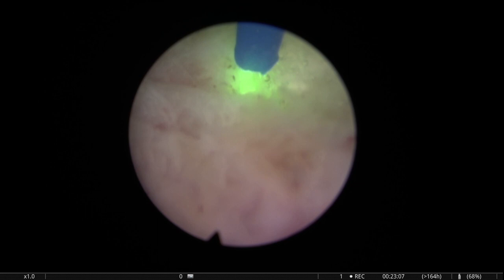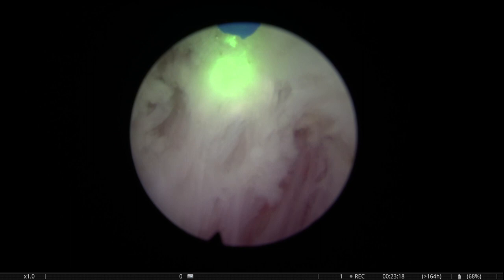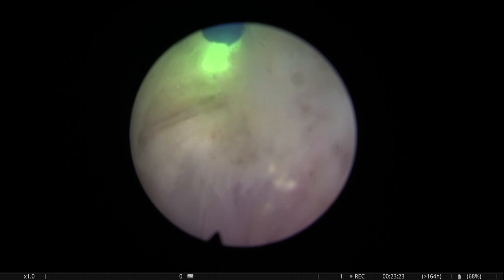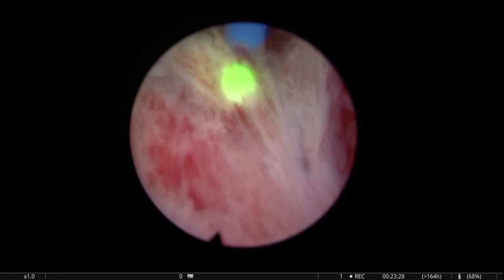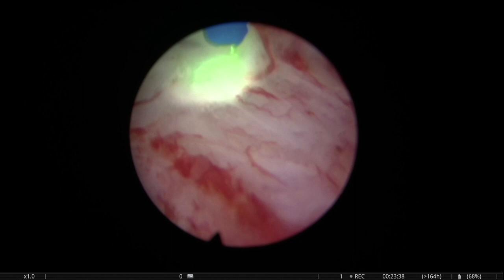So here, this is more anterior. You see, I'm taking my time, trying to find my way. One of the nice things of the en-bloc approach, even when you have a relatively difficult plane like this, where you have to search and probe and correct, and then you have double planes, is the visibility. When you have good visibility, you can progress. You understand what's going on, even when you have several little planes.